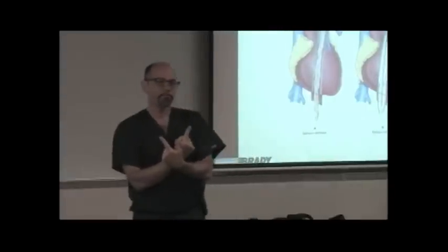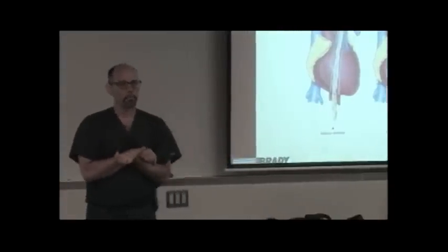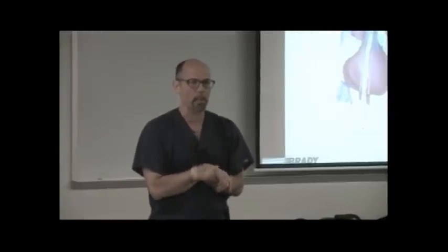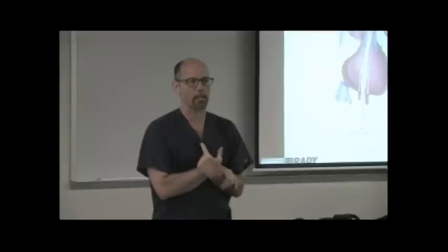Around here, in this state, very short, 3, 4, 5 days max. Why do you think that would be? What do you think is the most limiting factor to leaving a catheter like that in somebody?